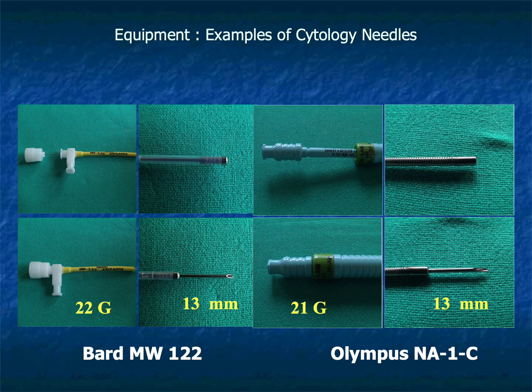Several needle systems are available for conventional TBNA. Some are designed primarily for cytologic aspiration, while others obtain small histologic core specimens. Needles vary in gauge, depth, and length, allowing operators to tailor equipment to the anticipated clinical situation.